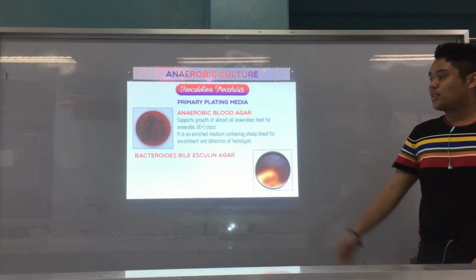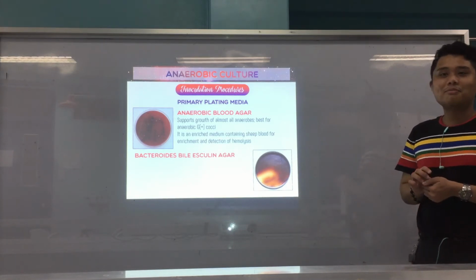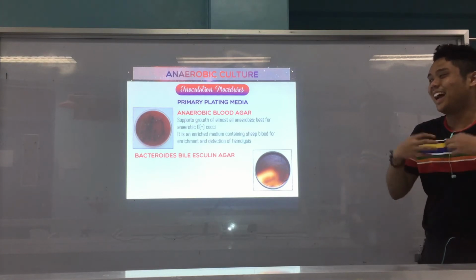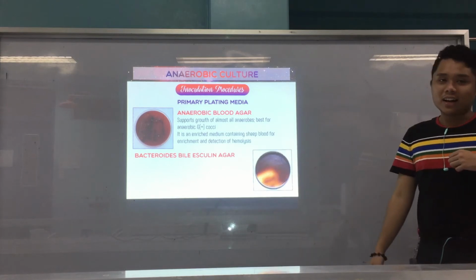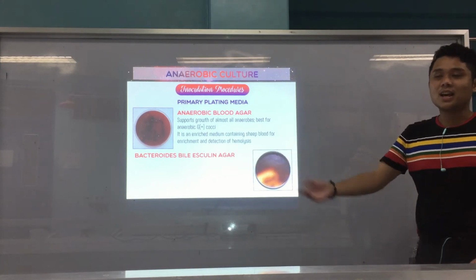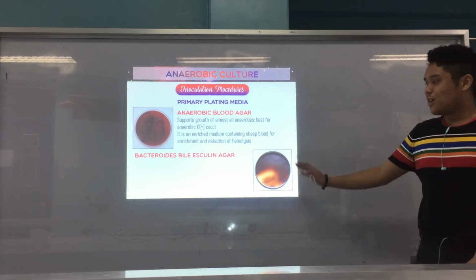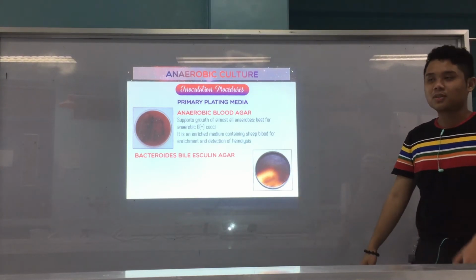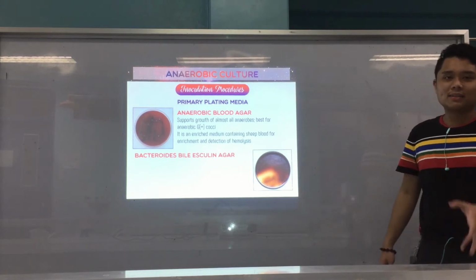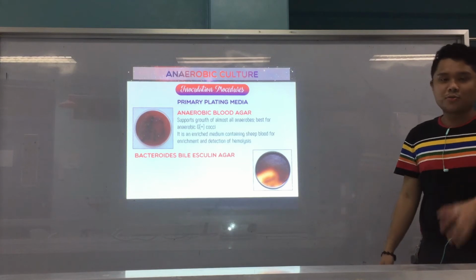Next, you have the BBE, or Bacteroides bile esculin agar. Not BBC, okay? BBE, Bacteroides bile esculin agar. As the name itself says, it's for Bacteroides, which is one of the most common anaerobes isolated from clinical specimens. Again, this is a specific culture media for anaerobes. It is not used as a plating media for aerobic organisms. It's usually reserved for anaerobes.